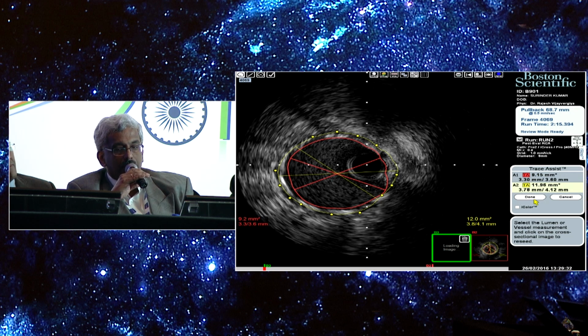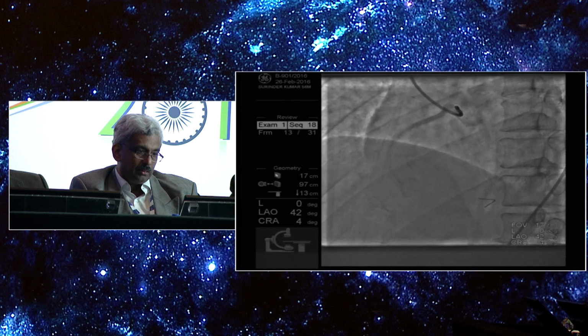Final result. Yep, Rajesh, thank you very much for a nice demonstration. This is what we have achieved. Final result. Thank you. Well done, Rajesh.